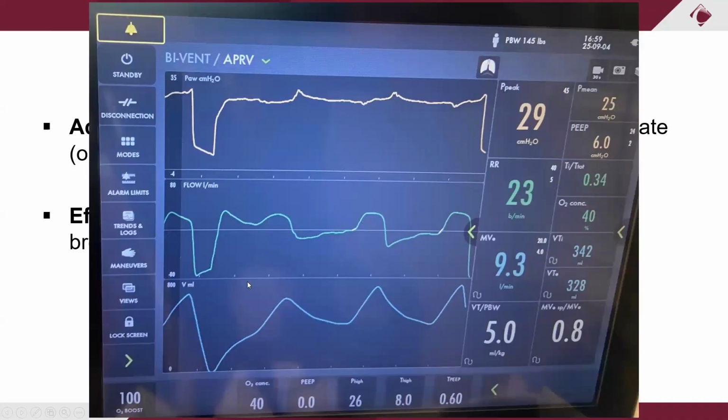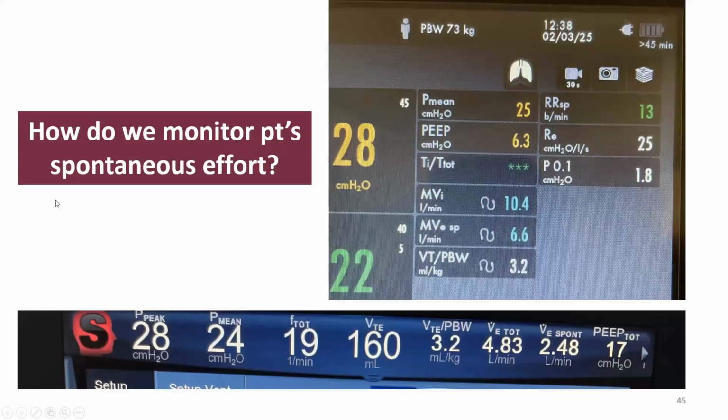So this one here, remember I showed you when we stretch them out from 6 to 8 seconds, and notice the whole pattern immediately changes once you allow that patient more time at the P high to take those breaths.